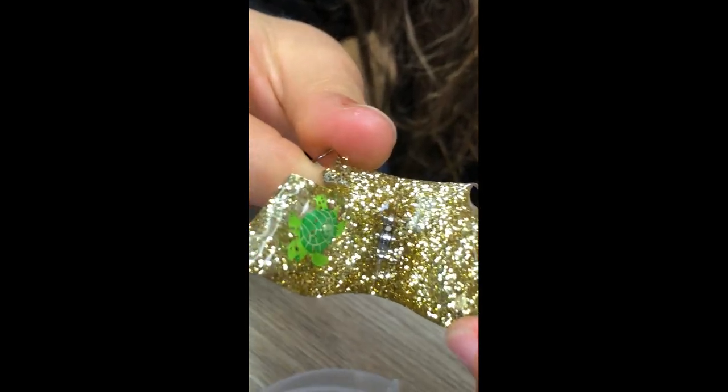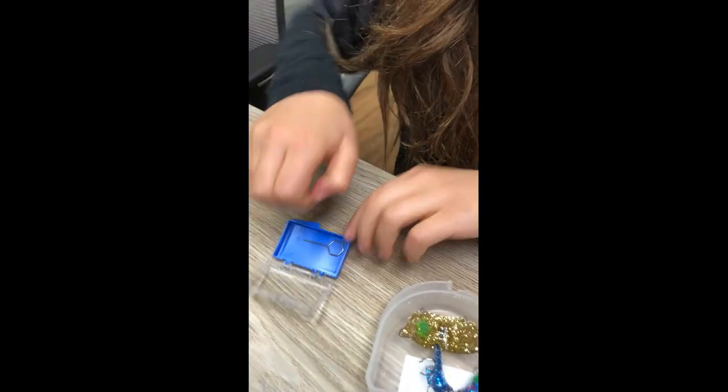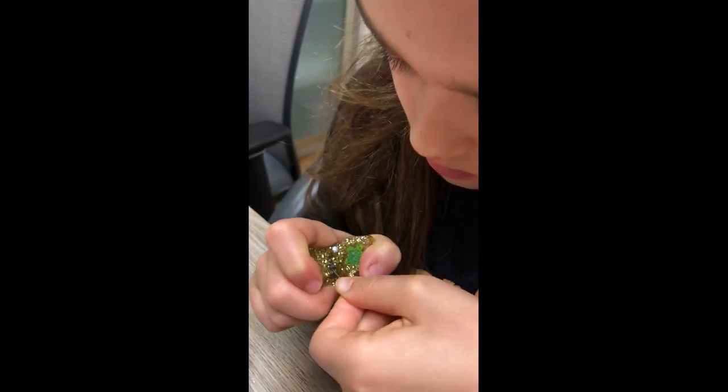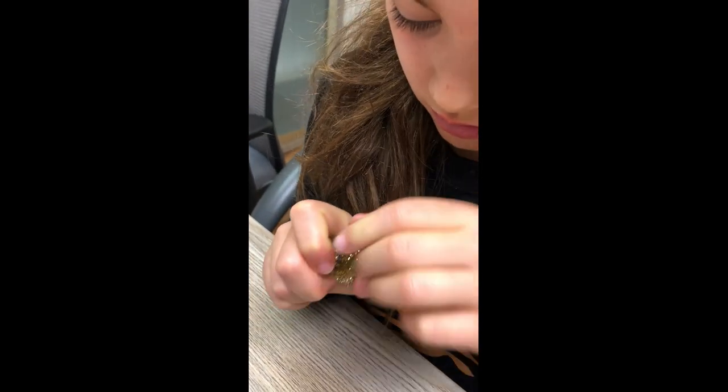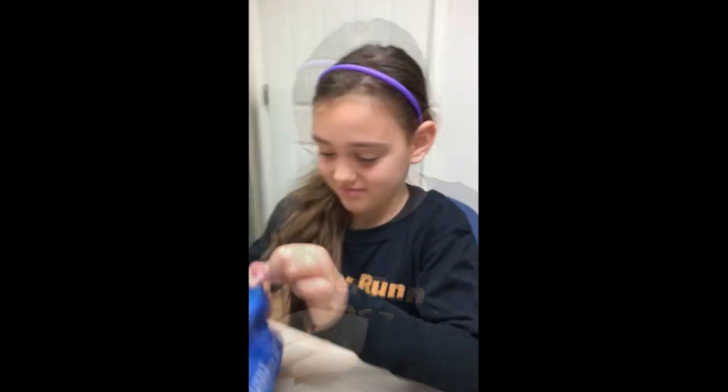Is that a turtle? Oh my god, it's so beautiful! Okay, so first we find the hole, and in the direction of the arrow — good job. We're going to do this twice a week. We're gonna put it on your calendar and you're gonna do it twice a week. Give me a big smile!